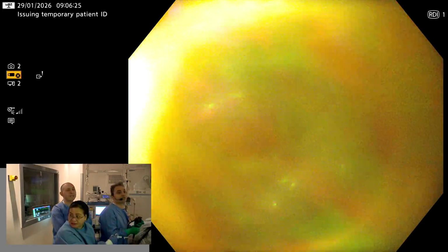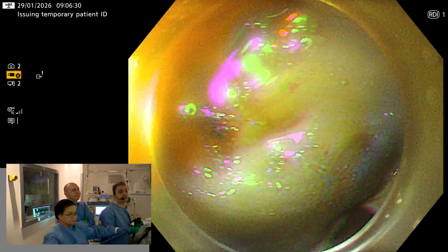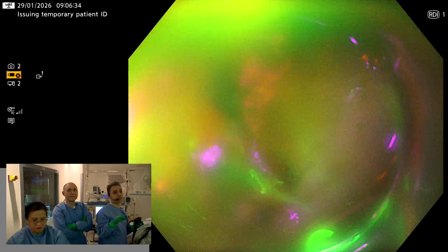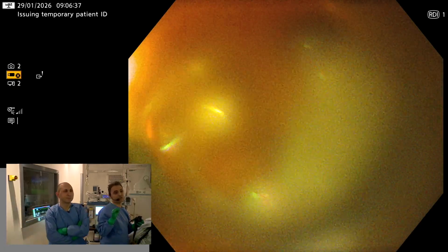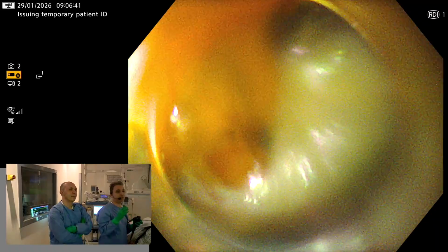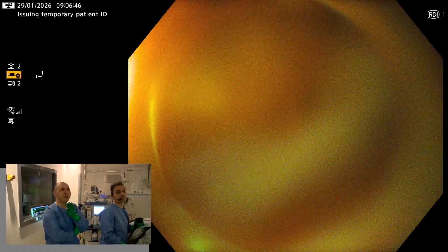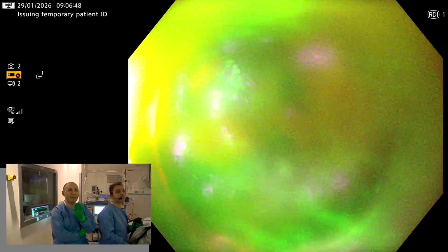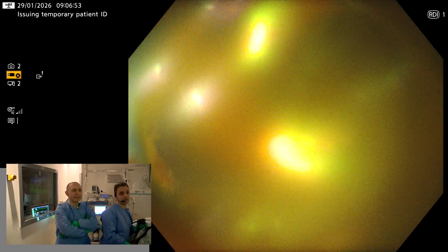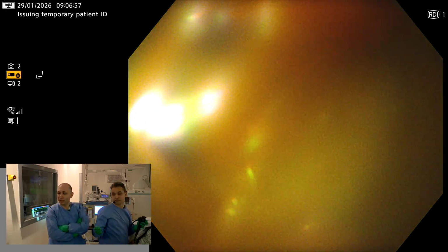The coag grasper is usually very, very crucial and mandatory. If I see that the bleeding is not controlled initially, although it is decreased, I go for the coag grasper. And please, I don't want to injure the muscle because in this area the muscle is just perpendicular to me. Sometimes we could make compression with the cap over the bleeding site as a tamponade until we prepare our instruments like the coag grasper.